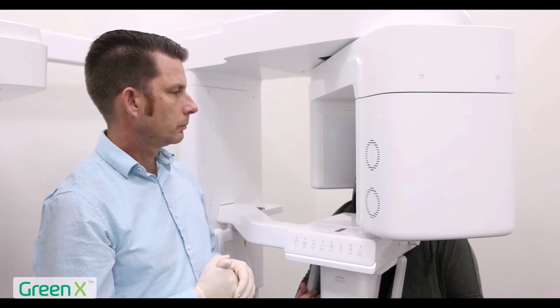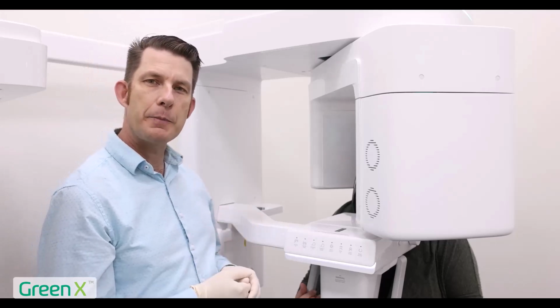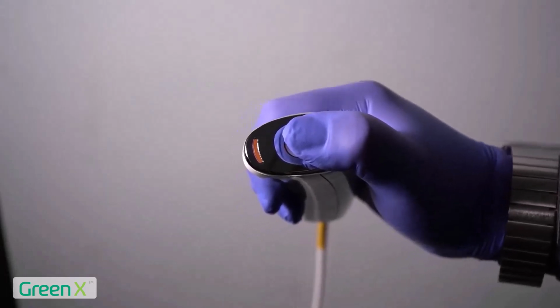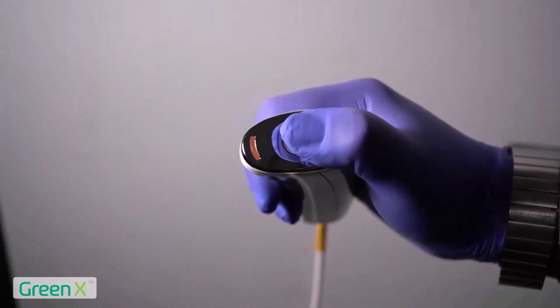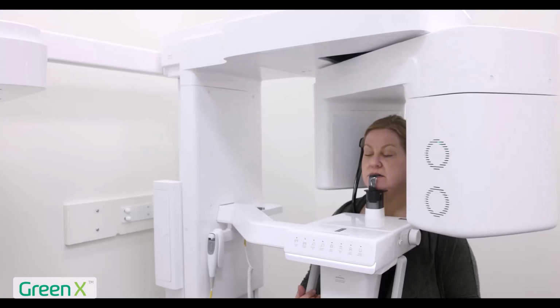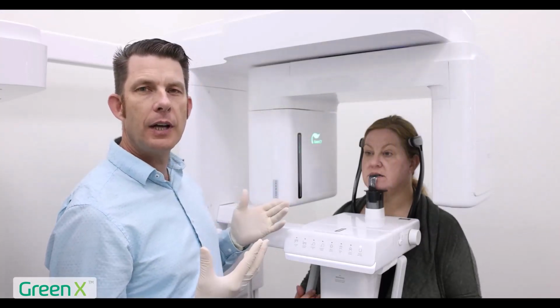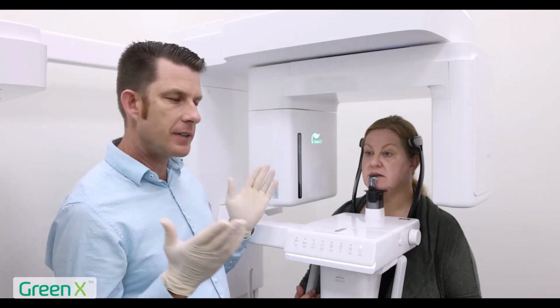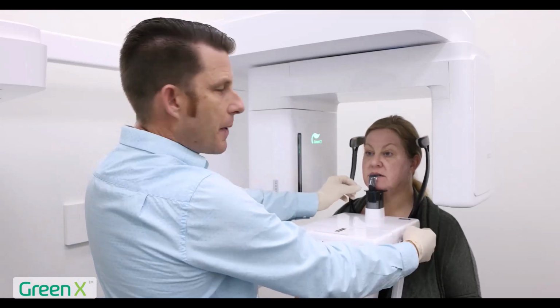Please close your eyes until image capturing is complete. Go ahead and step out of the room and capture our image. Hold the button on the acquisition trigger switch, which will turn yellow when exposing. Hold the button until the image acquisition is fully complete. Image capturing is complete. Please wait a moment. Once capture is complete, the device will have the patient open their eyes. The instructions I provided to the patient is I'm going to go ahead and open the temple supports and have them go ahead and step back and out of the device.